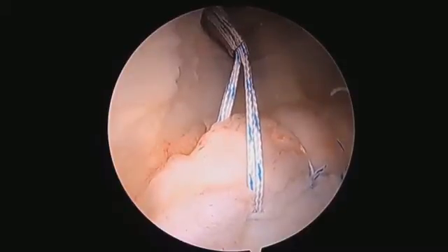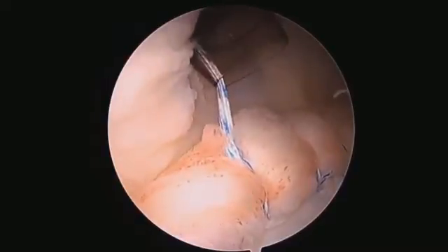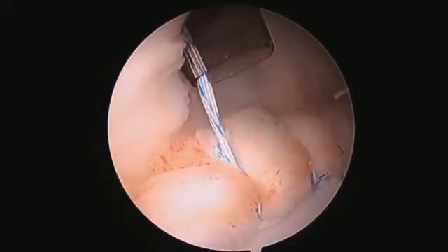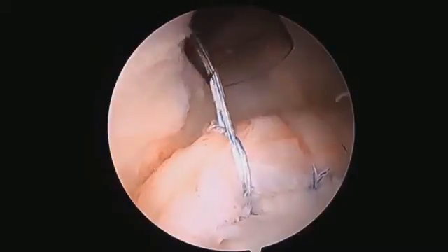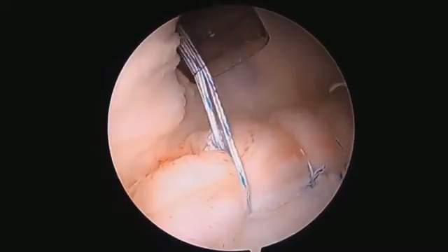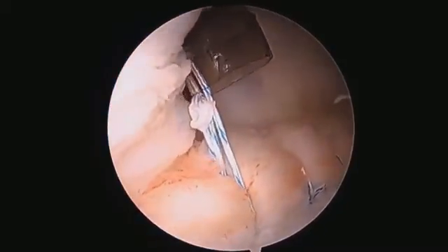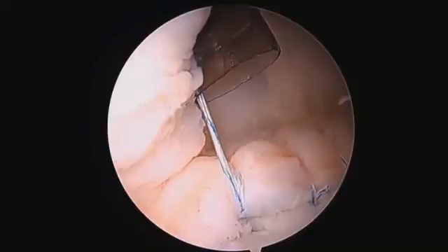That's the first part. Now you pull back and do the second stage. This is the very important part where you can toggle it back and forth a little bit, and then that last little bit of tightening — you can see how exceptionally tight it gets. The data behind this are just tremendous: how secure and how tight it is around there.